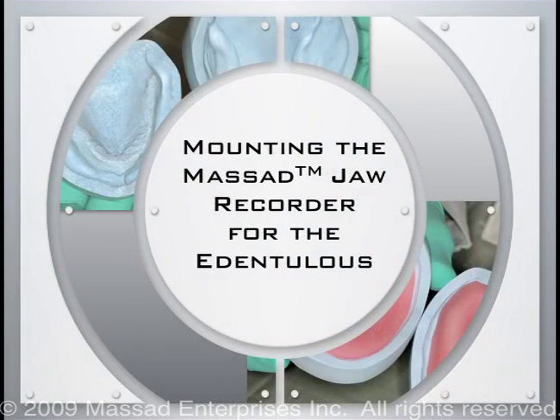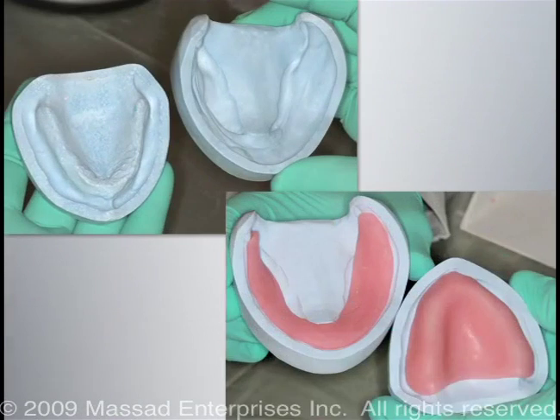Mounting the jaw recorders for the edentulous patient. On the upper left, we have 2 casts, maxillary edentulous cast and a mandibular edentulous cast. On the right, we have resin base plates, which have been fabricated in order to mount the jaw recording devices. These casts are made from the final definitive impression.